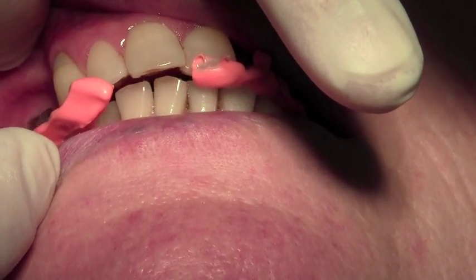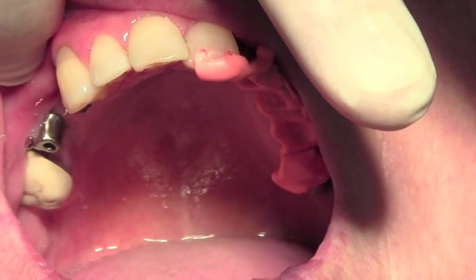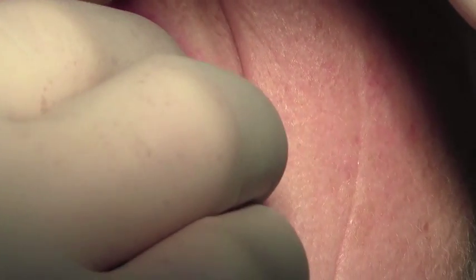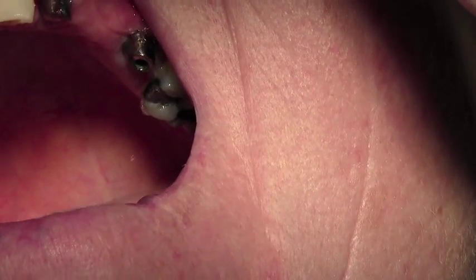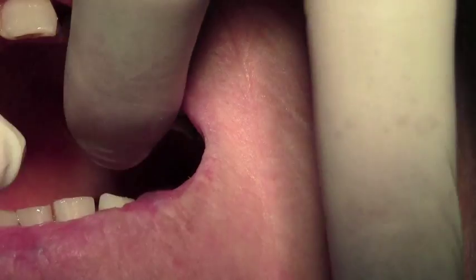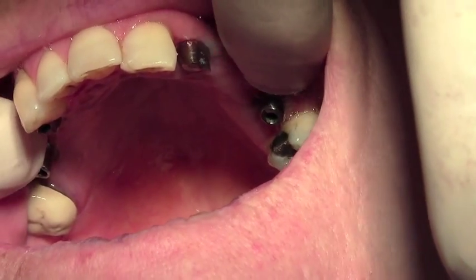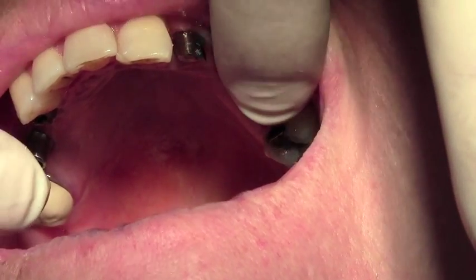So that's the right-hand bridge, and then the left-hand bridge as well. And you can see our abutments, which we're going to take off and reseat back onto the model, ready to go back to the laboratory.